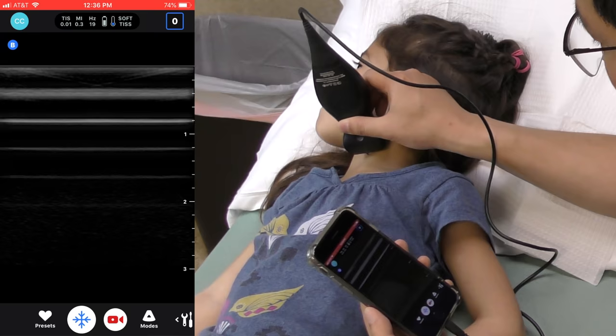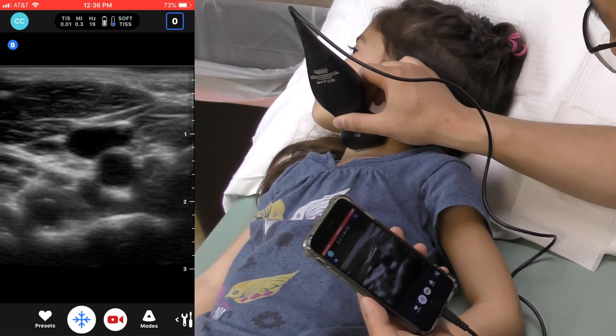The ultrasound images obtained are quite amazing, especially considering all the technology is bundled right into the handheld body itself.